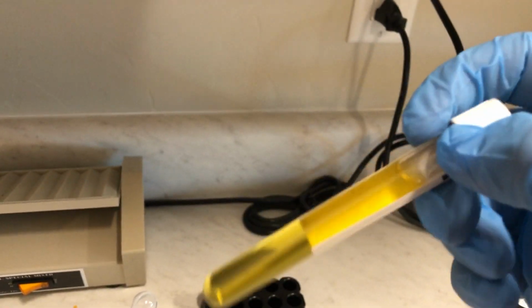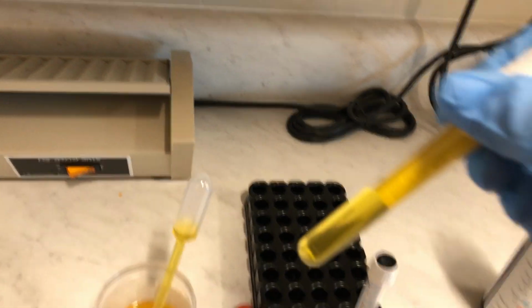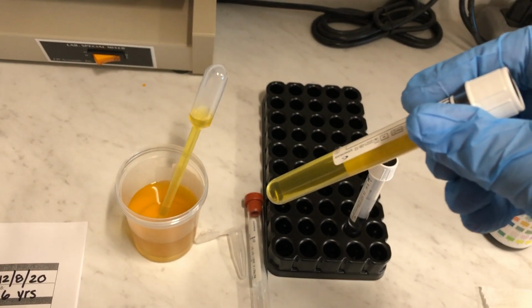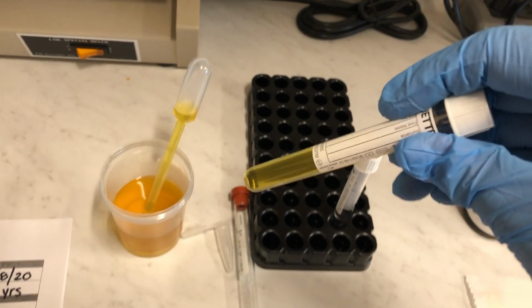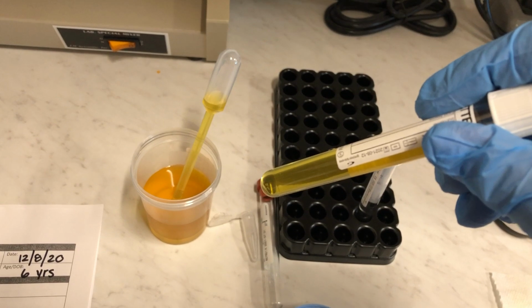Okay. And then you'll want to label the tube with the patient's name and information. If you're doing this in class for a lab skill with multiple people running the centrifuge at the same time, you might actually just want to put your name on the label so you know it's your tube, because you'll probably all be using the same sample.